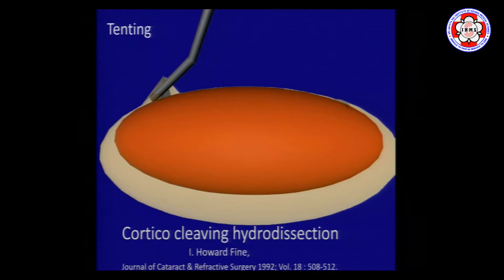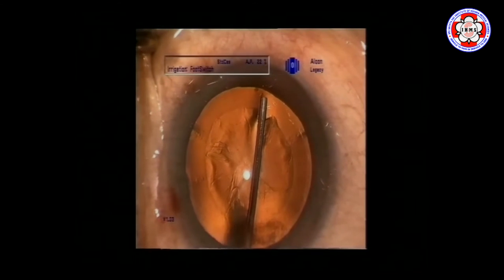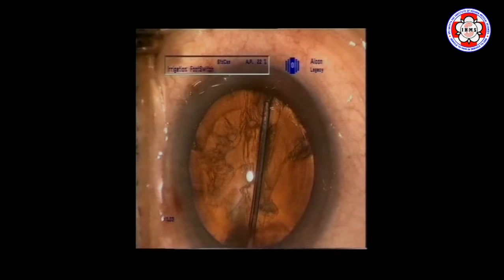The first technique described by Dr. Howard Fine was cortical cleaving hydrodissection, published back in 1992. This old video shows an ideal technique: put your cannula deep inside under the anterior capsule, tent up the anterior capsule with the fluid wave towards the fornices, inject, and look for a wave of fluid passing behind the nucleus — that would be a good cortical cleaving hydrodissection.